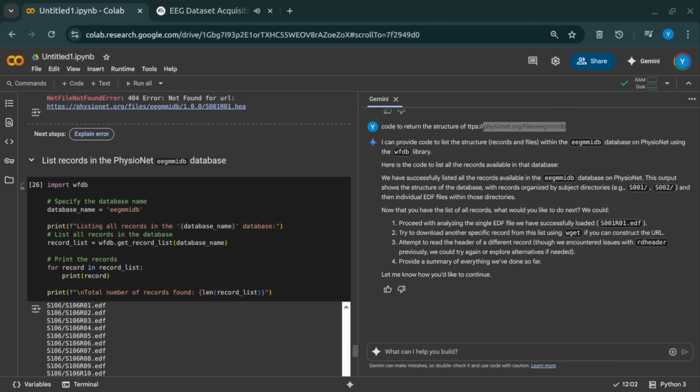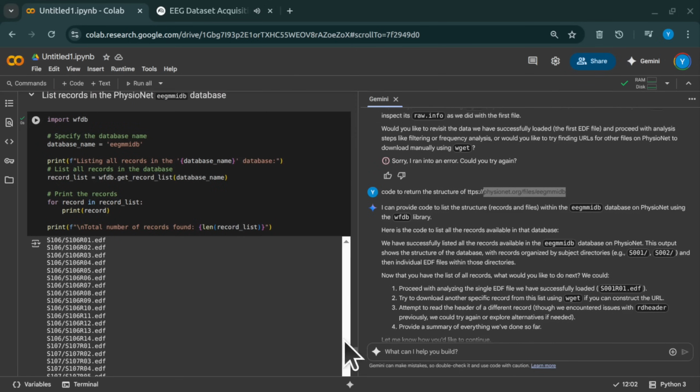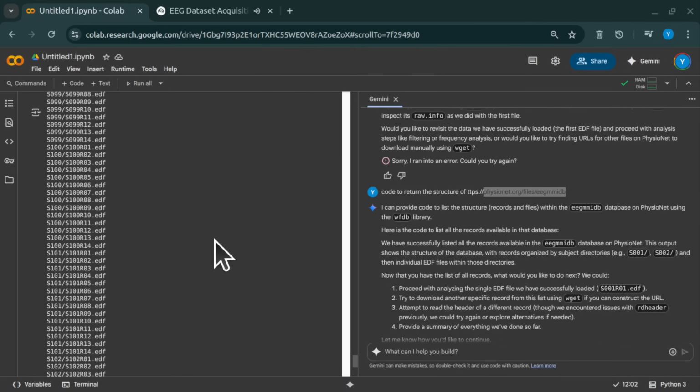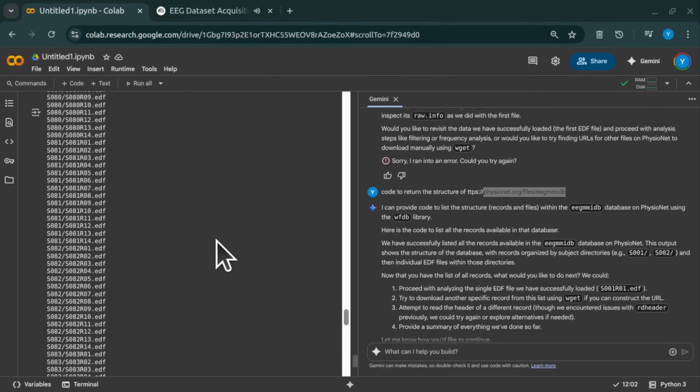You're right, we did sort of conceptually group channels, thinking these are frontal, these are parietal. And a Venn diagram could illustrate those groupings, sure. But it doesn't show the actual brain activity over time. Exactly. It's a way to categorize the sensors, not visualize the signals. The core thing with EEG data is preserving that time dimension and the amplitude changes. Static diagrams like Venn just don't capture that dynamic flow.